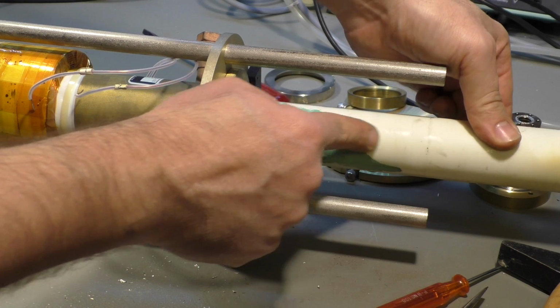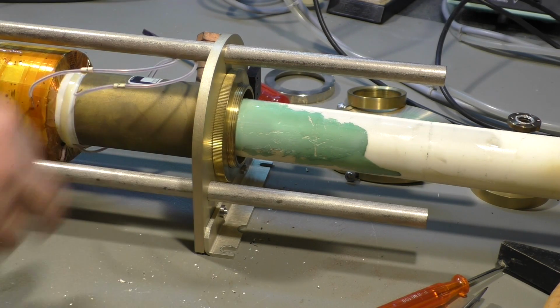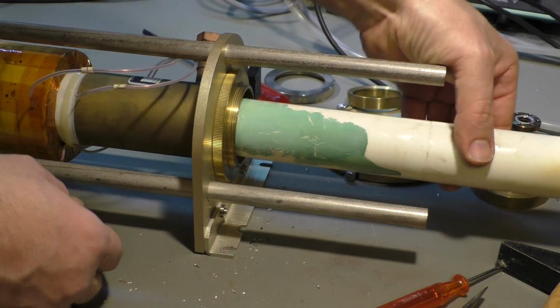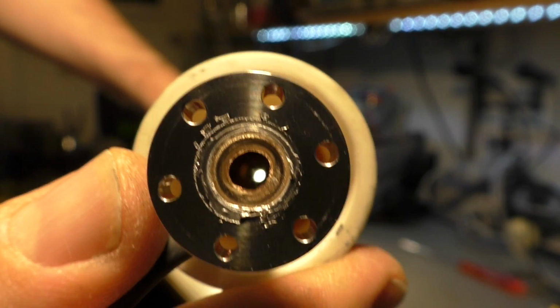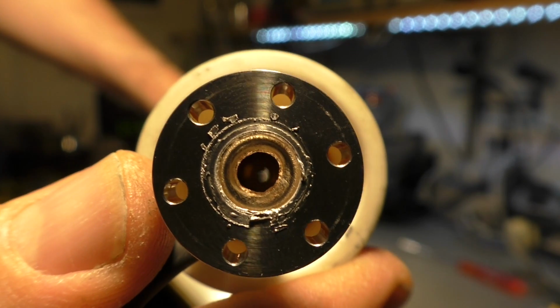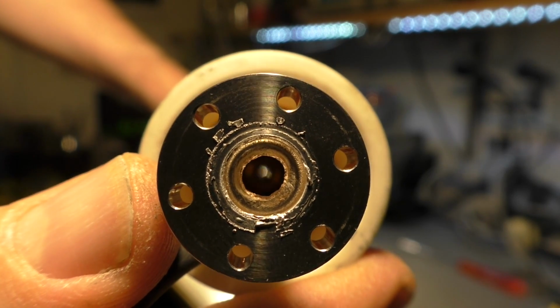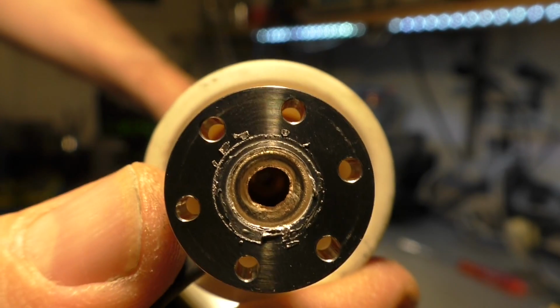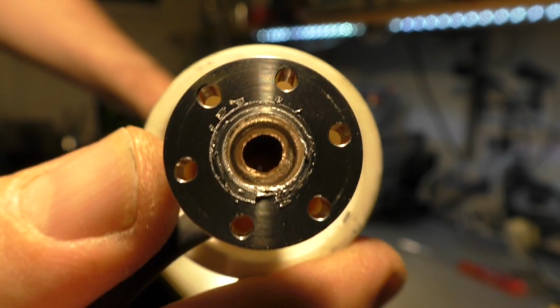There's some greenish stuff. I think that's some copper oxide. You can see it now. There is nothing optical inside. It's just a tube. The mirrors we have already removed. That's it.